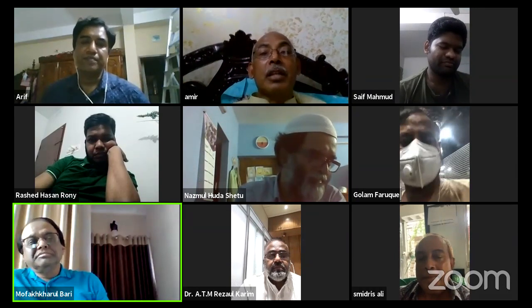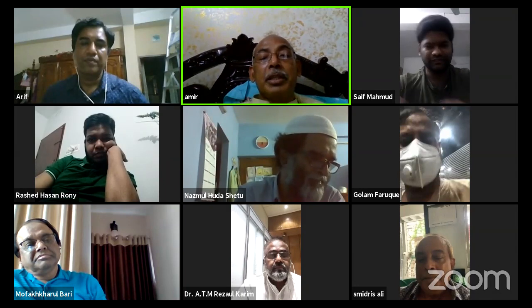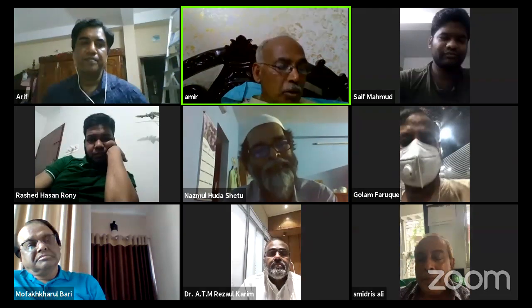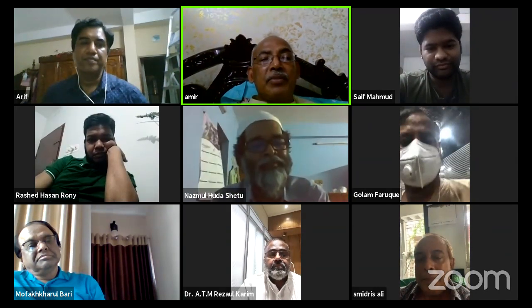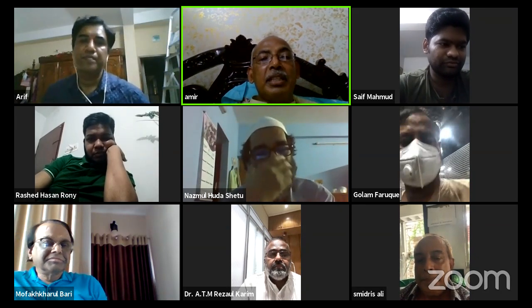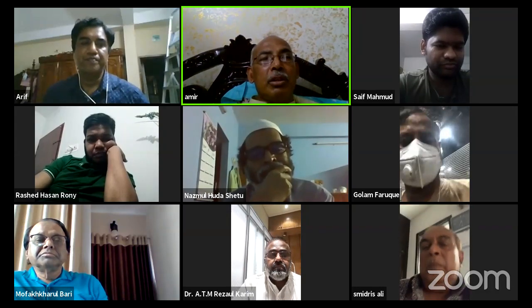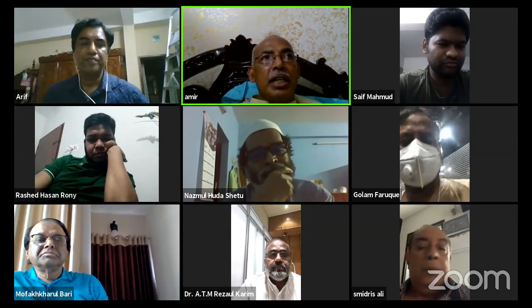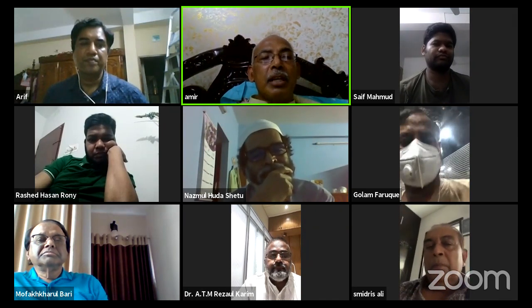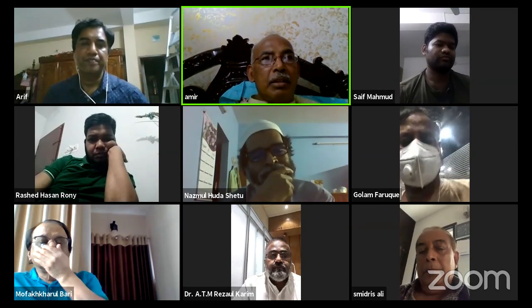Okay, thanks a lot, Dr. Arif, because you speak elaborately on lower limb deformity correction. But I also favor acute docking first and then lengthening, and correction by lengthening. Because as you see in this X-ray, a 40 year old man with deformity in the lower leg, with rotation and angulation, you correct this by gradual lengthening and correction of rotation.